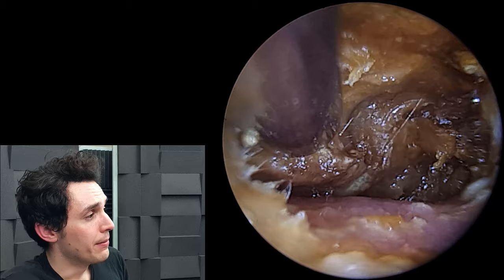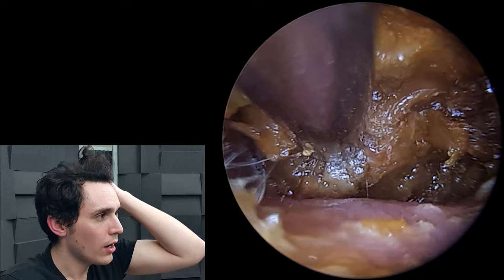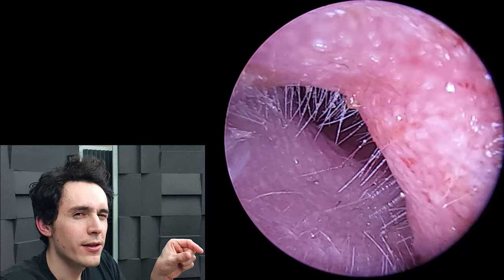The acetic acid is very good at dealing with bacteria and fungi, and it can deal with biofilms — essentially little colonies of bacteria that form and proliferate, like plaque on your teeth. Biofilms can form on dead skin inside the ear canal. That little white arrow is showing a window we've created through to the eardrum — so we are making progress, just very slowly.